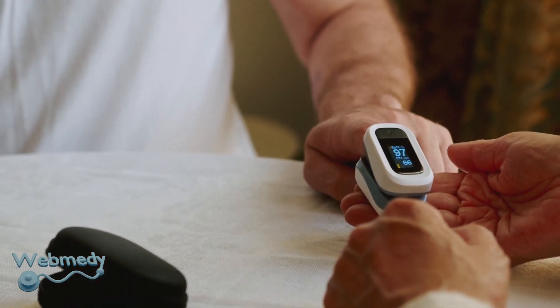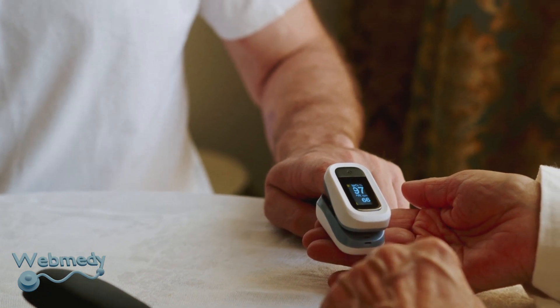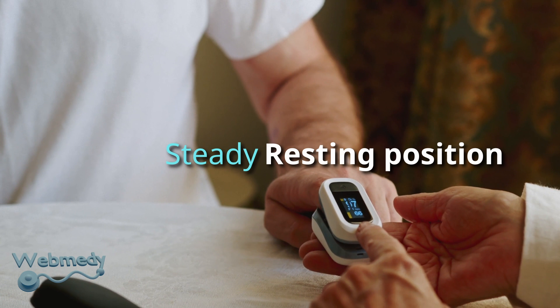Take the test reading, preferably sitting. Make sure your hand is relaxed, warm, and below heart level. The hand should be steady and in a resting position.